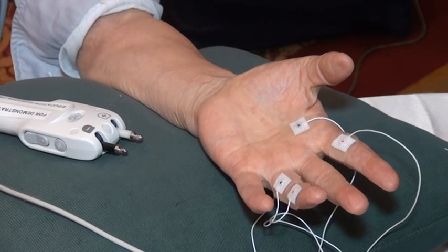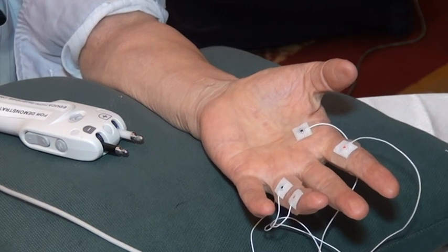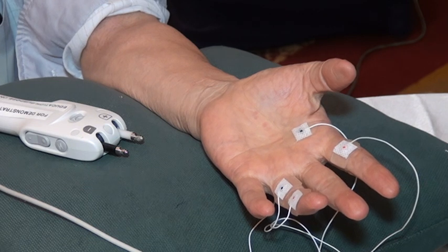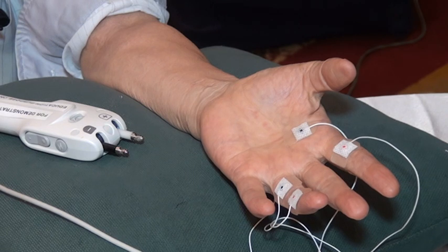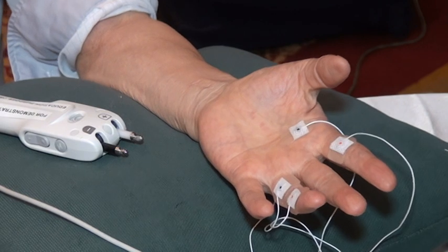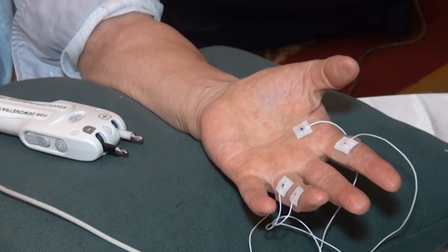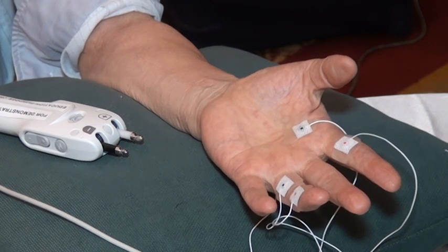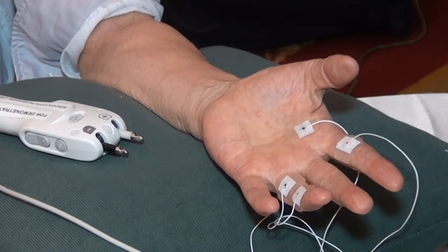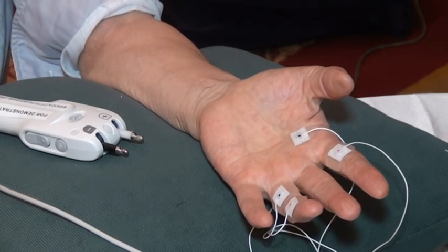You are wrong on two counts. First of all, I'm asking you the name, and it's not called motor artifact. This is not an artifact. What is it? This big one is called the motor potential. It has many names: M response, CMAP, but usually it's called motor potential. So what would you call the little guy in front of it?